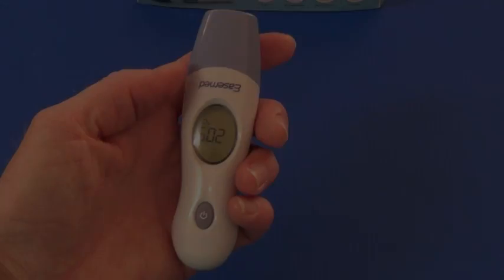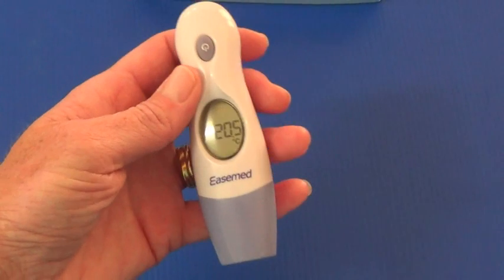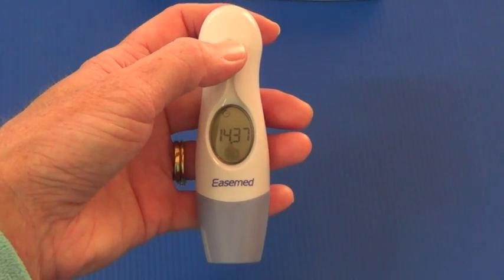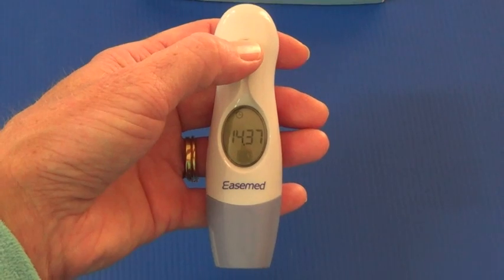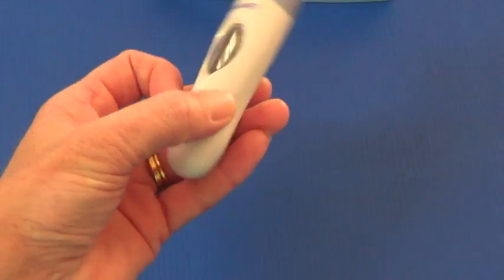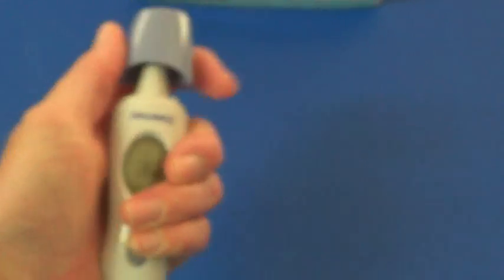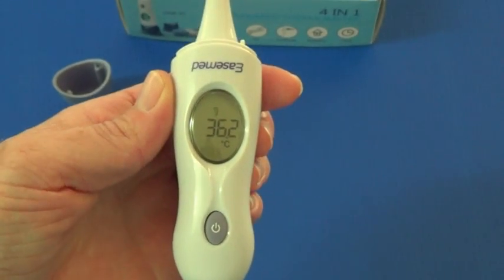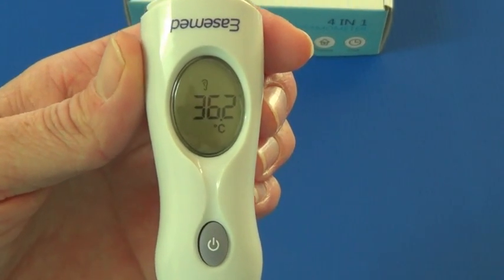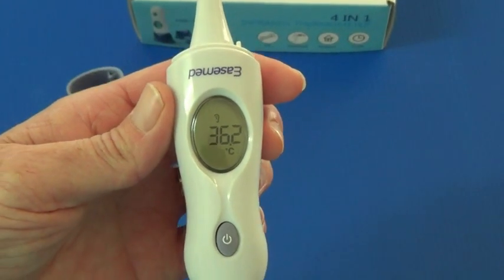We enter into the ear thermometer mode. You will need to press the scan button once to activate. You will see the last temperature reading has been displayed. Simply open the cap cover and there you will see the icon of the ear to show it is ready for the ear thermometer mode.